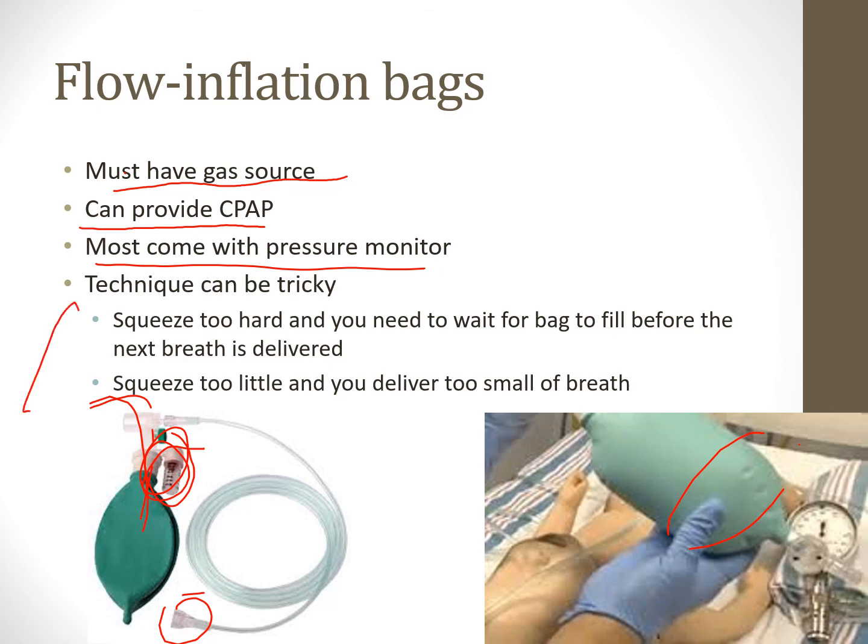Here's one of the other things with this. The technique can be tricky. If you squeeze it too hard, you might need to wait for the bag to fill up again before you can deliver the next breath, right? It's not self-inflating, it's flow-inflating. If you squeeze it too little, you might deliver too small of a breath.